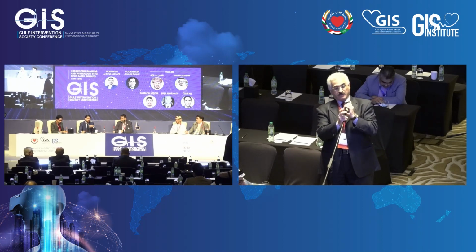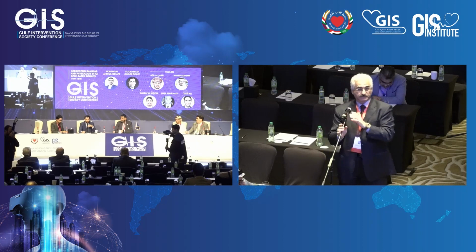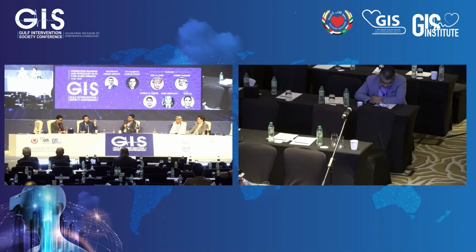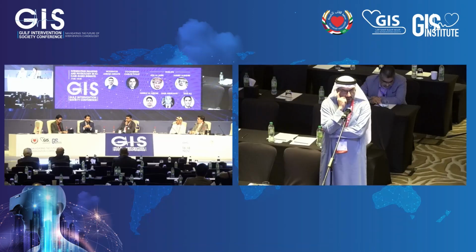Okay, so that's a very good question, and that's the very question that drove us to develop PPG. And the reason is there is no standardized diagnostic criteria to say what is focal and what is diffuse. So everything that we're talking about here in the panel refers to physiologically diffuse disease. In other words, pressure pullback without any pressure drop, and that can now be quantified by PPG. We have this metric of PPG we were discussing yesterday. The next trial is going to use a cutoff of 50. Less than 50 we will not treat, even with positive physiology, let's call it that way. More than 50 is a case for PCI. And this is how we see the field moving forward.